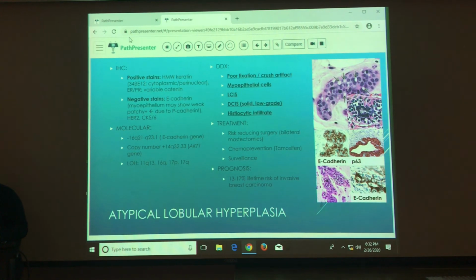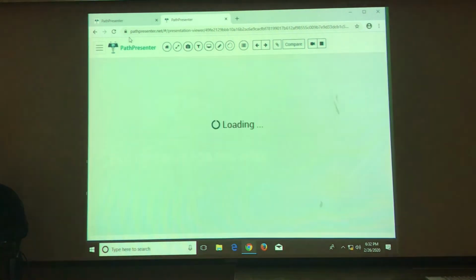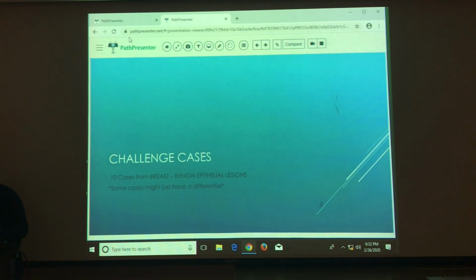Okay, so that's what I have for you guys. So, challenge cases, 10 cases. That should give you an idea of how much pickings I had to choose from for this lecture. Most of the things are things that we went over in the lecture. I think there's 1 or 2 cases that are a little different. And there's one where you can tell me, oh, I went this way versus that way. But all those are just up there for you guys to take a look at.